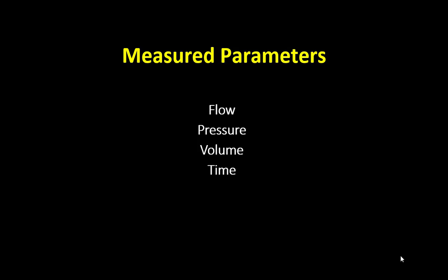So, we all know that the four parameters which are measured on our ventilator screen are basically flow, pressure, time, and volume. All those scalars and loops which you see on the screen are just a mix and match of these four basic values.